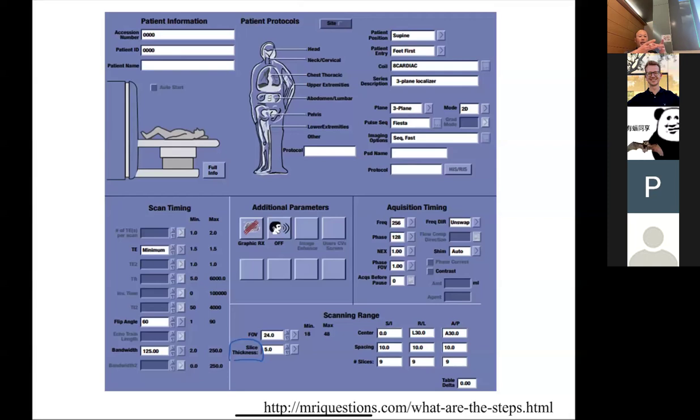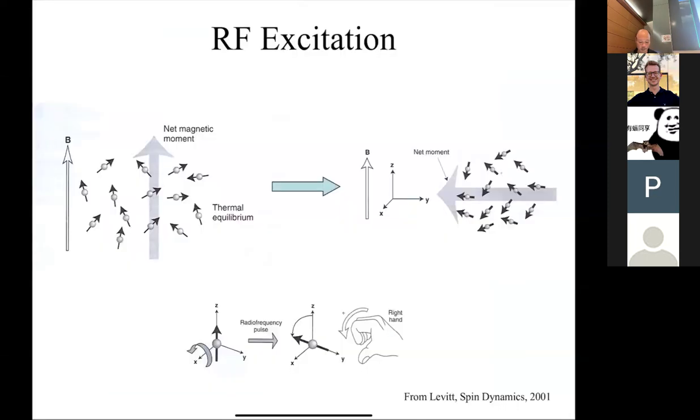And so for each slice, we're just going to do the 2D Fourier transform of that. So that's basically using everything we studied in this course. Now, it is possible to do 3D imaging as well, in which case there's not really a slice. You're doing X, Y, Z, with 3D Fourier encoding. So that's the other option as well. Okay. So we're just going to focus on the 2D imaging, what you would do for slice excitation.